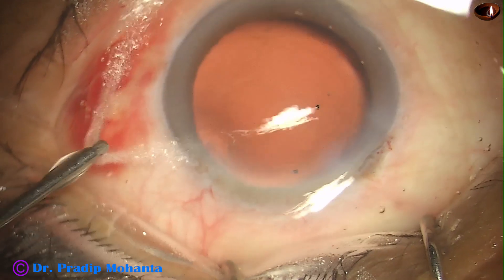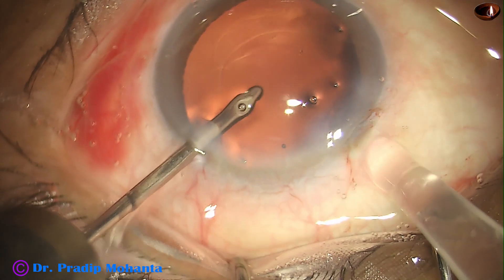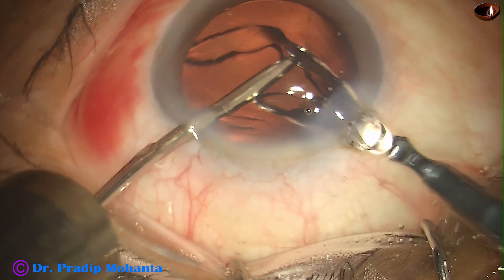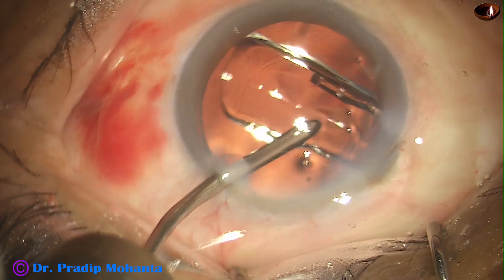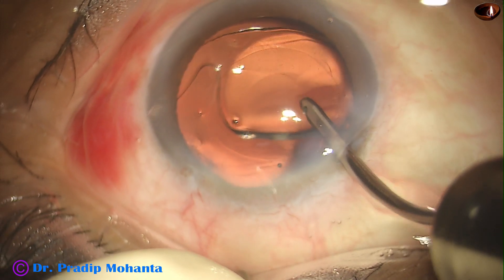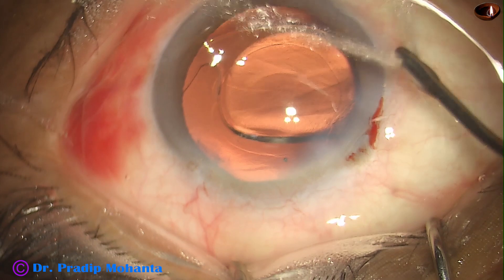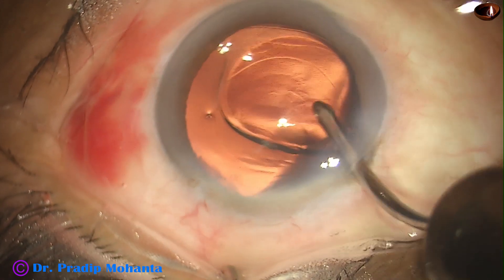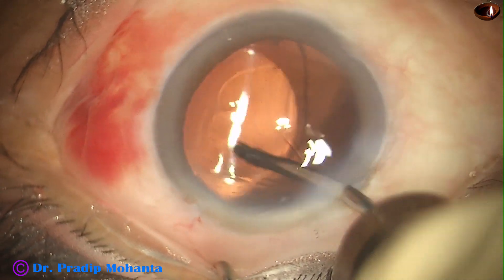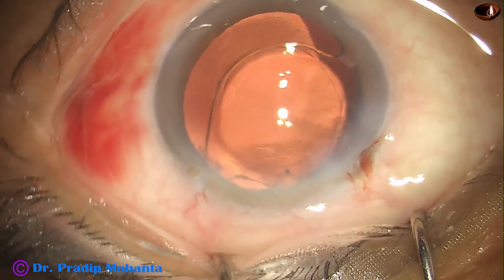This is hydro-implantation of Supraphobe from Appa Sami Associates. Supraphobe is a hydrophobic, single-piece, non-aspheric intraocular lens. It's a beautiful lens — no glistening has been observed in three years of follow-up. The unfolding of the lens is slow, so it will take some time to get centered.